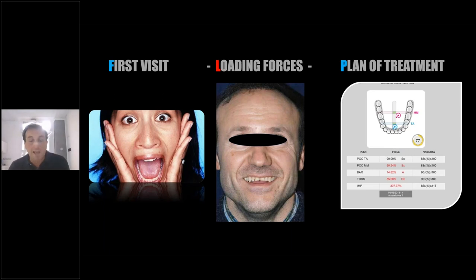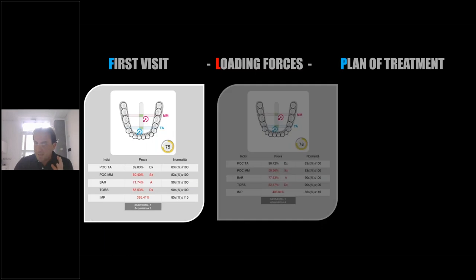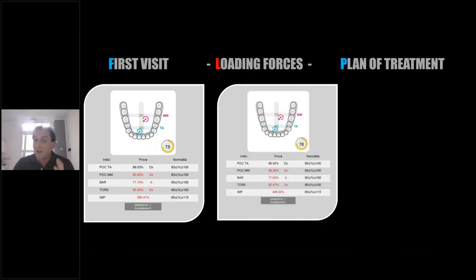And for that, I use Teethan in my daily practice. I can change the muscles, but I can also control the force of the patient. And so I think it's not a mistake, because I can find this exam or a similar exam in other patients. And when I have a brachyfacial patient, I have a high level of impact. You know that?